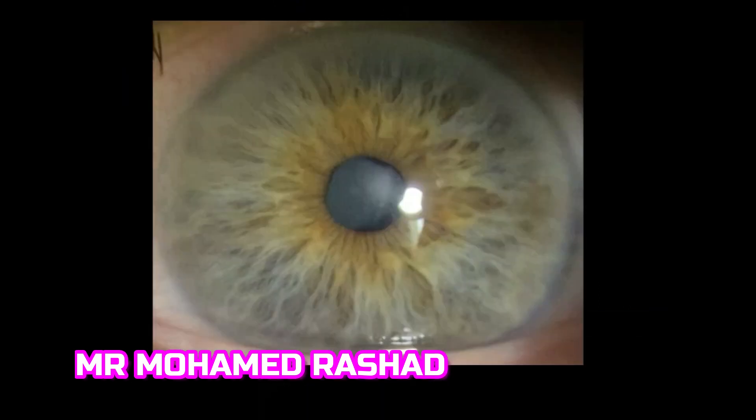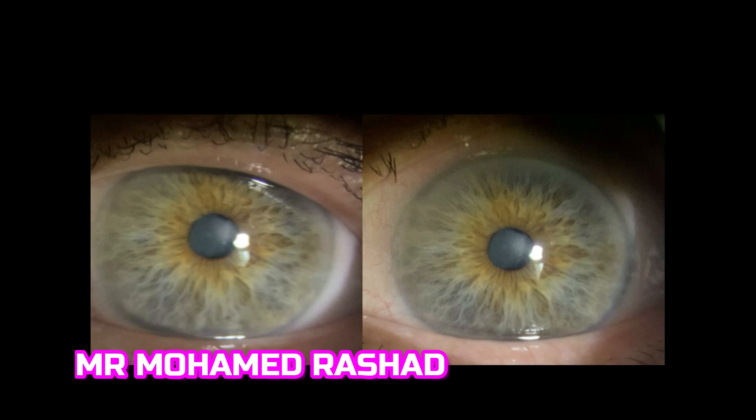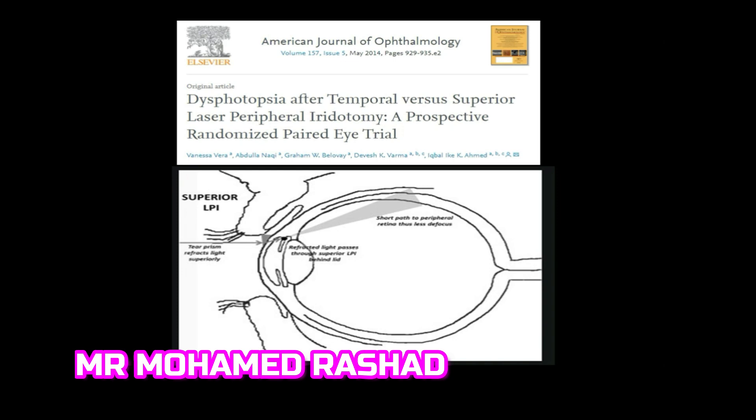Regarding where to place the laser peripheral iridotomy opening, I usually examine the patient at the slit lamp and identify the superior marginal tear strip. Avoid doing the opening under this marginal tear strip meniscus, identified here by the red arrow and red line. A recent prospective randomized trial found that dysphotopsia is less with temporal opening than superior opening.